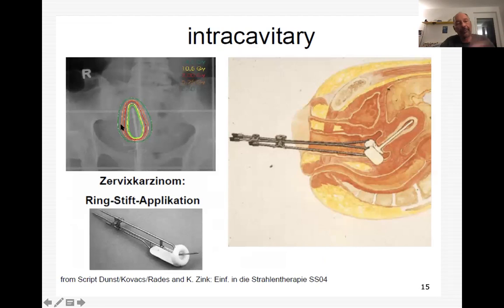The treatment plan, now this is a color palette. I'm sorry, I should have shown you teletherapy before, so you understand the color palette better. You see that the needle is shown here in the CT, and the color palette corresponds to the doses. It goes from 14.5 grays, green, 10 gray here, and then this is an area of low dose.